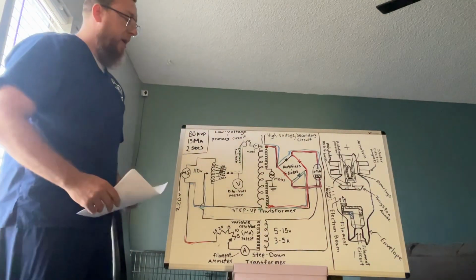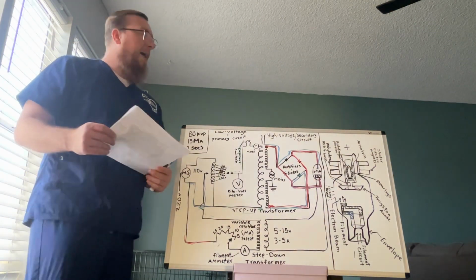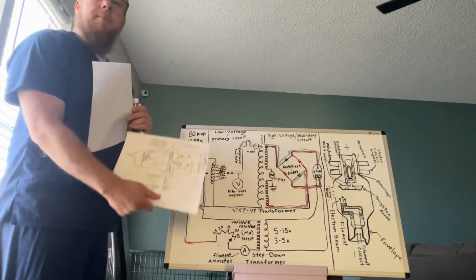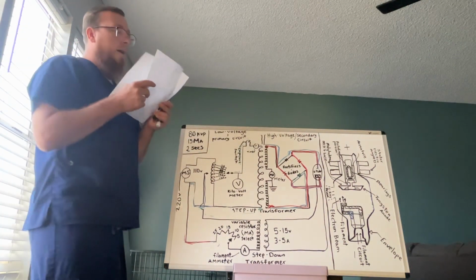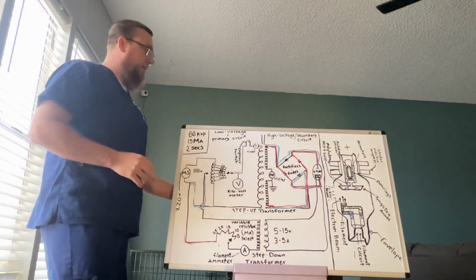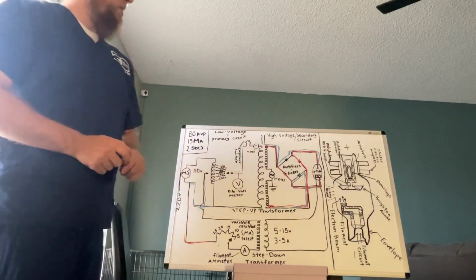This is my presentation for my X-ray circuit and my X-ray tube. As you see, I have drawn a diagram of my X-ray circuit as well as a diagram of my X-ray tube, and I will explain to you how they work. I'm going to start off with the X-ray circuit.